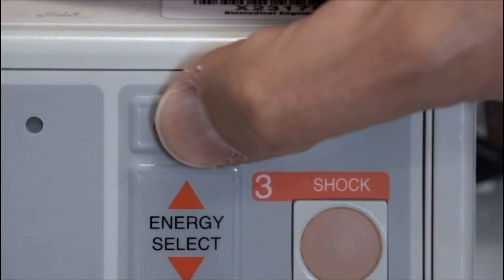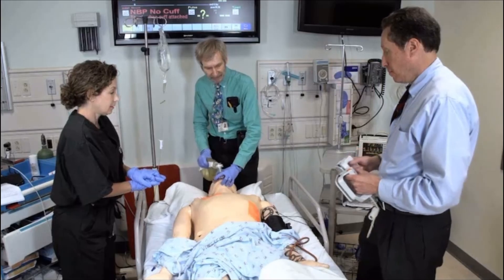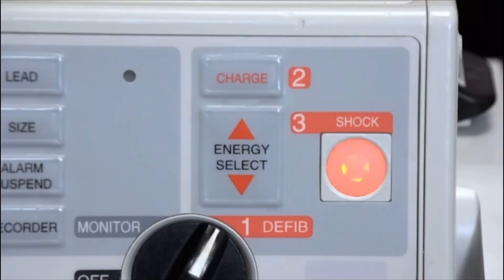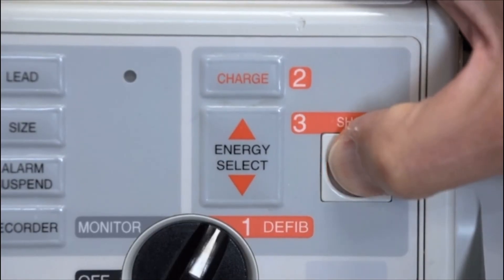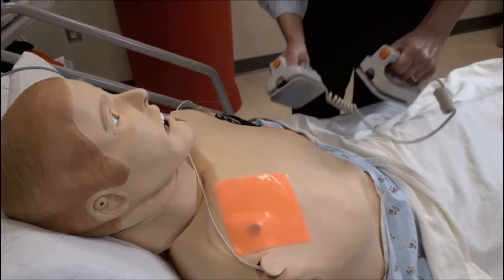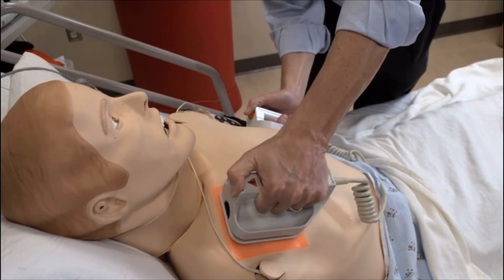Press the charge button. When the machine is charged, loudly state all clear, and look to ensure that no personnel are touching the patient or the patient's bed. If using pads, deliver the shock by pressing the button on the machine. If using paddles, press down firmly on the chest wall and push buttons on both paddles at the same time.